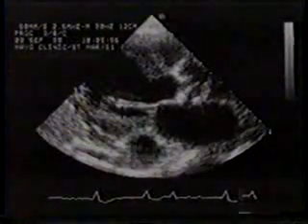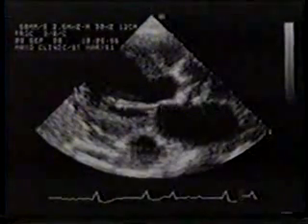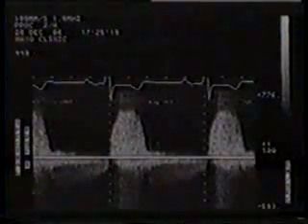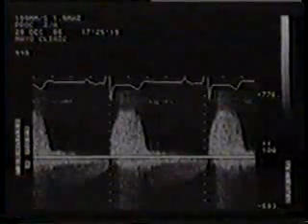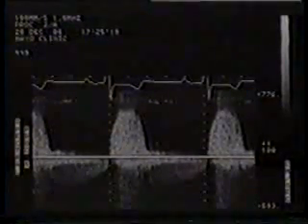Assessment of aortic valve disease is a common referral to the echocardiographic laboratory. The addition of Doppler techniques to standard two-dimensional imaging permits non-invasive assessment of the hemodynamics of aortic valvular dysfunction. In particular, the ability for the echocardiographer to accurately determine the severity of aortic stenosis is having a profound impact on clinical management of these patients.